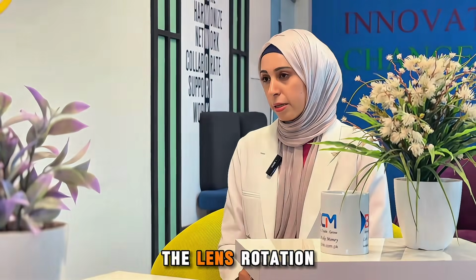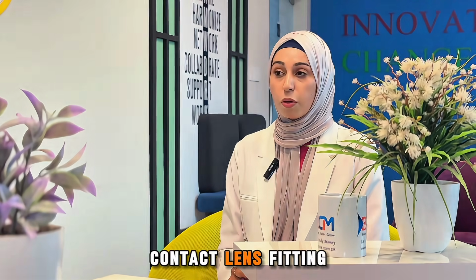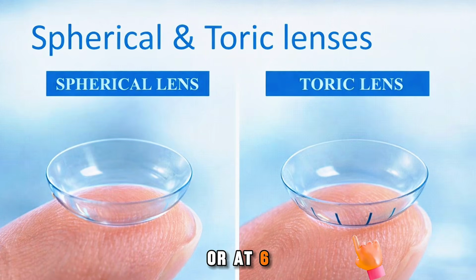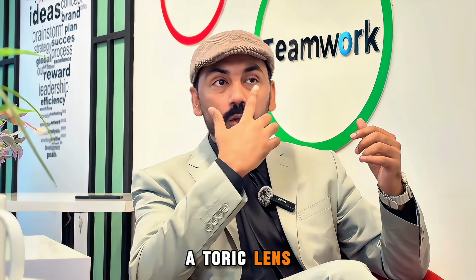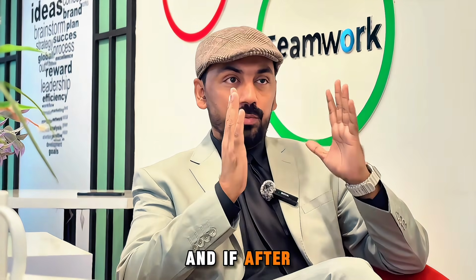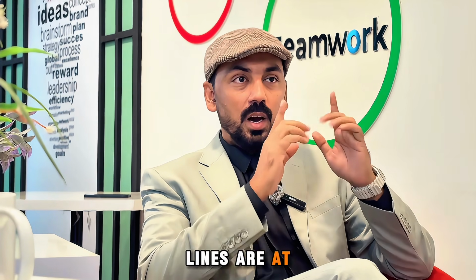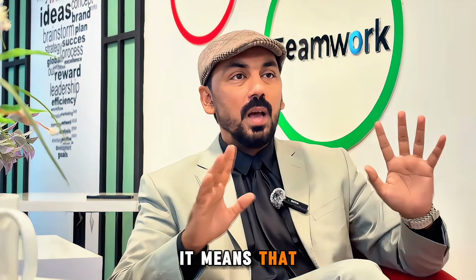Sir, as you said, lens rotation is the biggest problem in soft toric contact lens fitting. So how can we avoid this lens rotation? We have laser lines or laser dots on the toric contact lens at the inferior side, or at the 6 o'clock position. For example, if you insert a toric lens in the patient's eye, and after a settling period of 10 to 15 minutes, that dot or these laser lines are at the 6 o'clock position, it means that your lens is well centered, your lens is fine, and the axes are at the appropriate position.